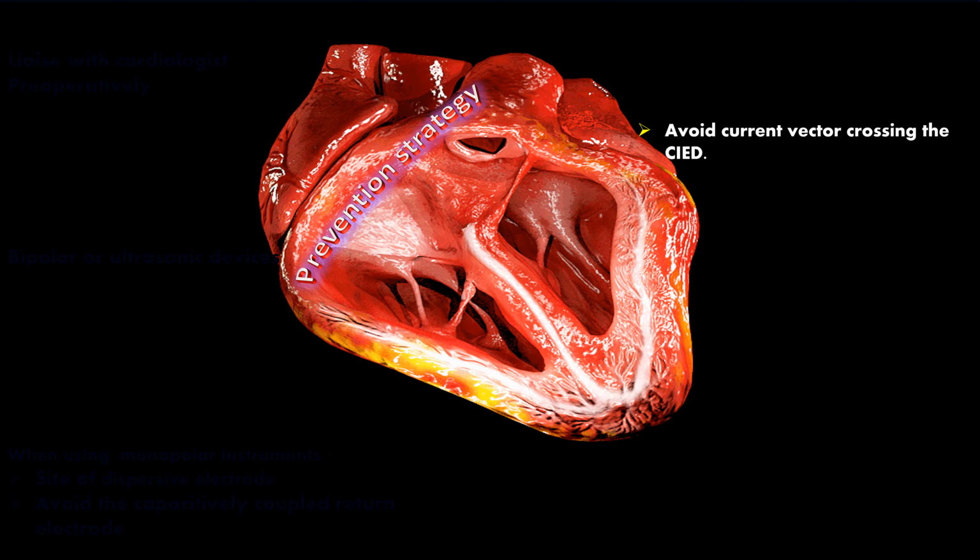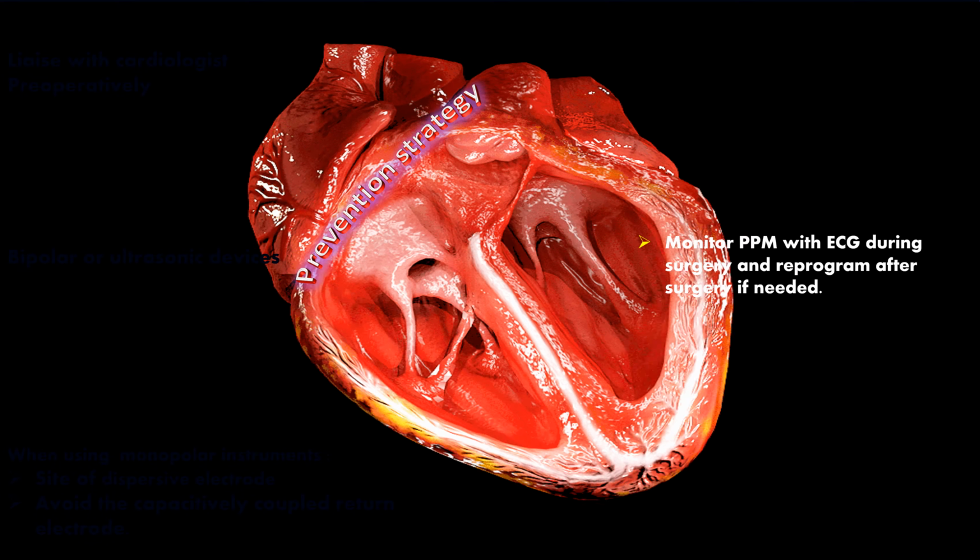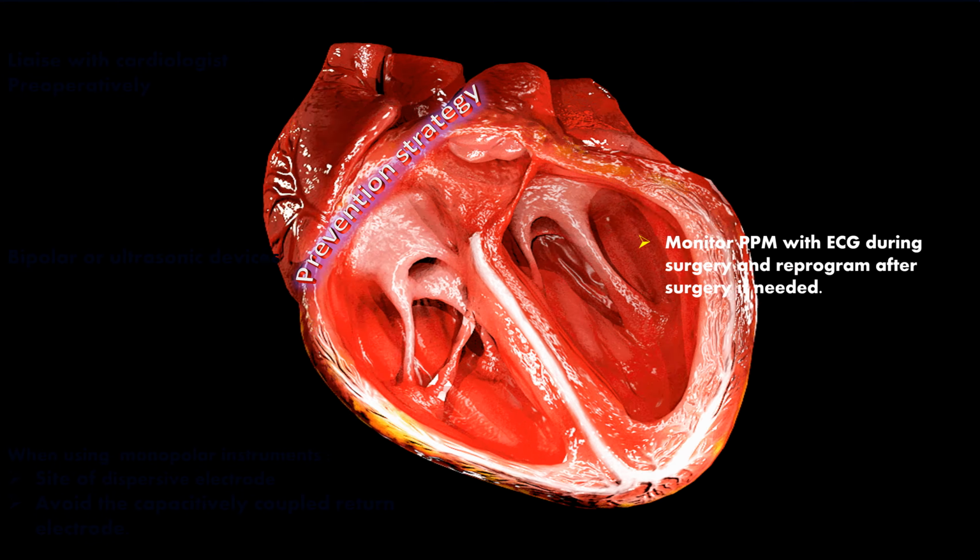Avoid current vector crossing the pacemaker. Monitor the patient's pacemaker with ECG during surgery and reprogram after surgery if needed. Deactivate the ICD just before the surgery, then activate it after surgery if there is no cardiologist available. Perform advanced life support in case of cardiac arrest.